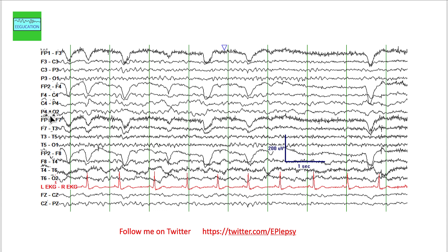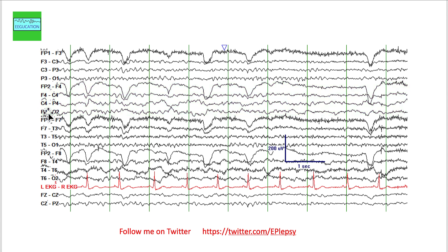As with anything in neurology, EEG is just an extension of the neurological examination. What I want you to do is compare the first four channels with the next four channels and see if you are able to identify any differences. Pause the video and try to identify what is different between the first four versus the next four channels.